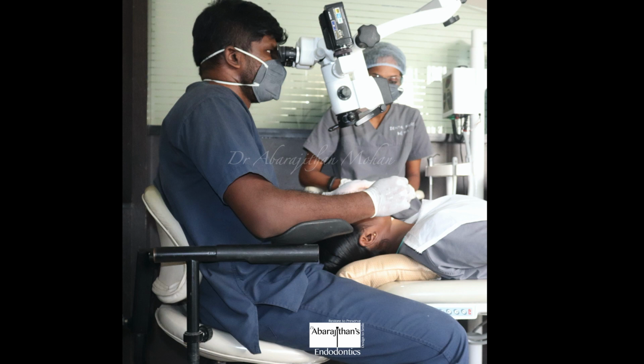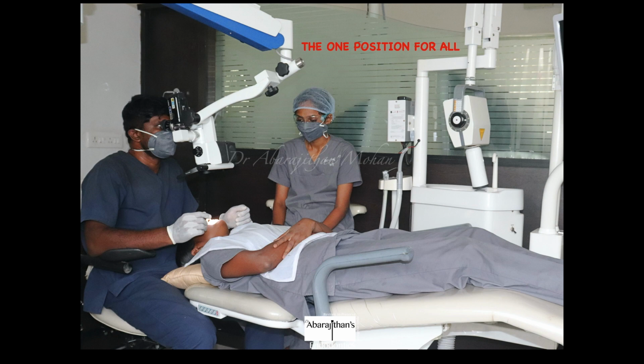So you can see here, this is the most convenient position for the operator. He sits at a 12 o'clock position with his thighs parallel to the floor, with the back supported and the neck erect, and still at focus on the work. And this is the single position with which all the procedures are being done.